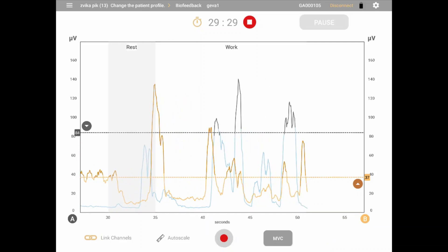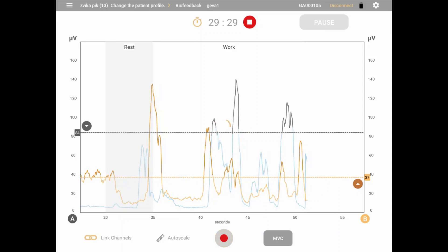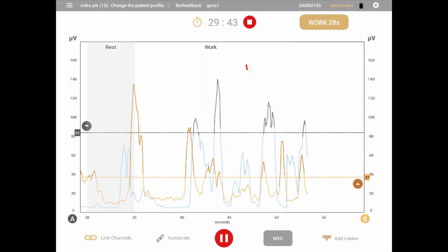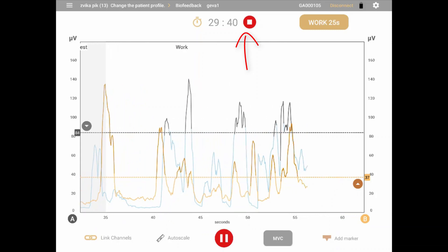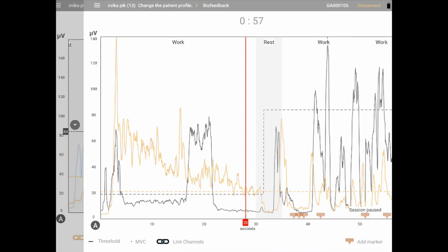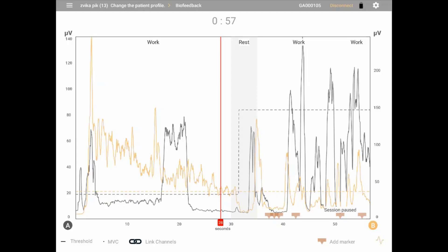Click the pause icon on the bottom of the screen to pause the session, allowing you to resume when desired. To stop the session and go to the review screen, click the stop button on the top of the screen. When a session is finished or stopped manually, the review screen will appear. If saved, this screen is also accessible from the patient file by clicking Review from the main menu and selecting the desired session.